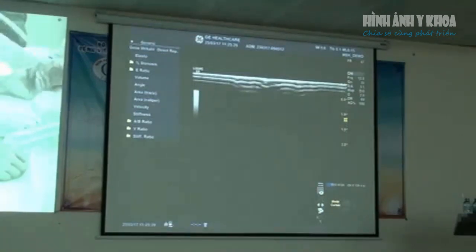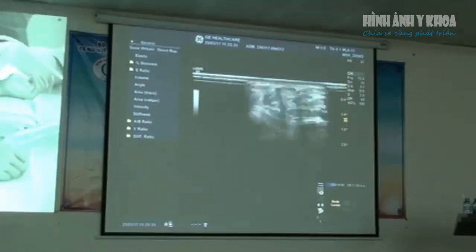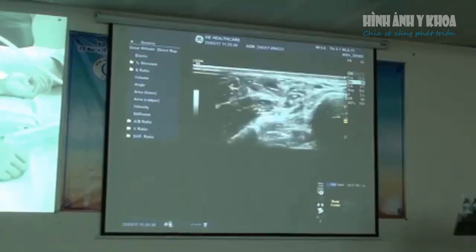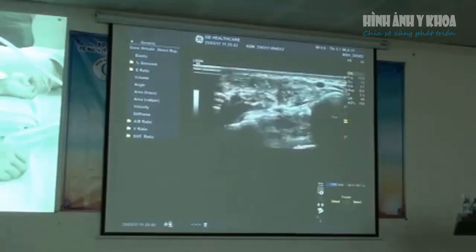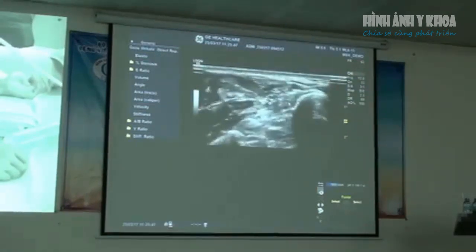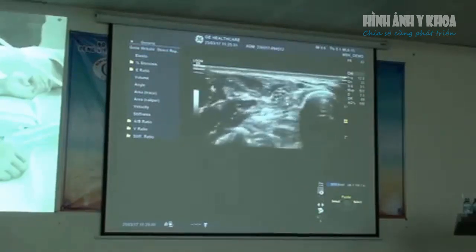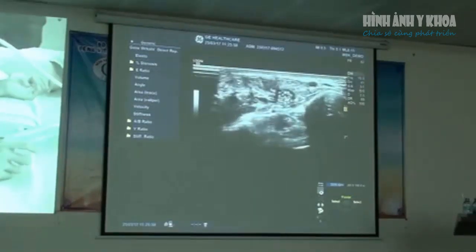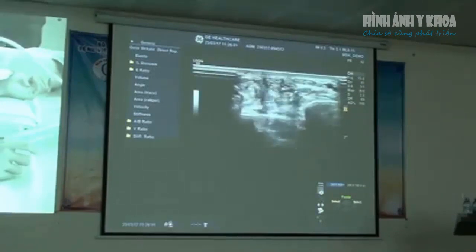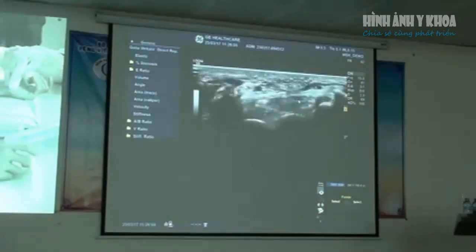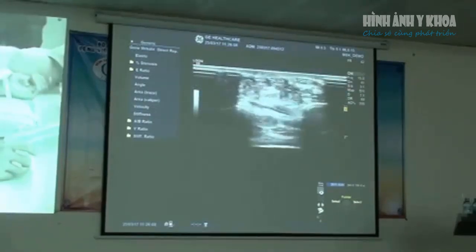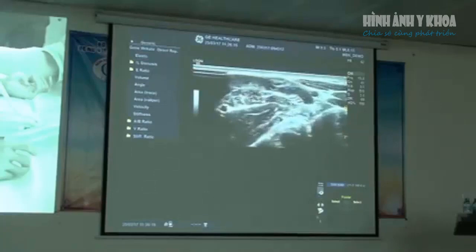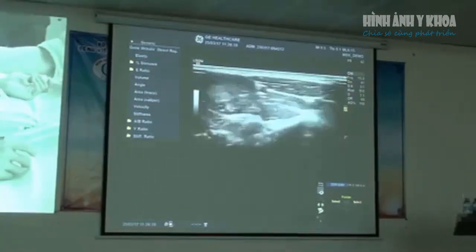To have a look at the volar aspect of the wrist, we can check the median nerve. To optimize the nerve, start off a little bit higher in the forearm. Then by using a nice smooth movement, you're actually able to watch that nerve come up and over and then into the carpal tunnel. You can see it coming up through the muscle planes, so you're able to follow it normally all the way up.